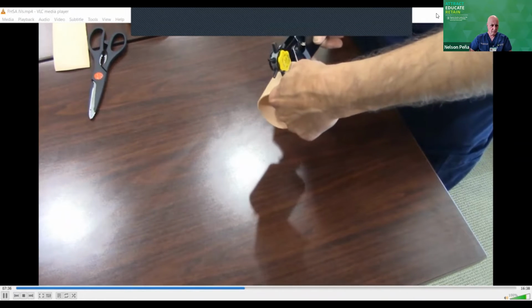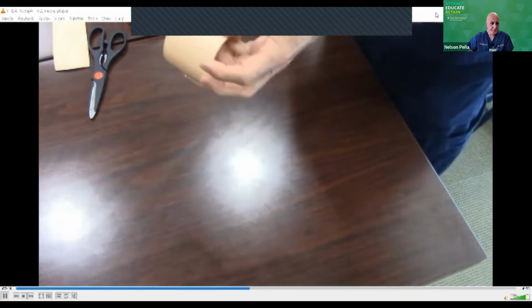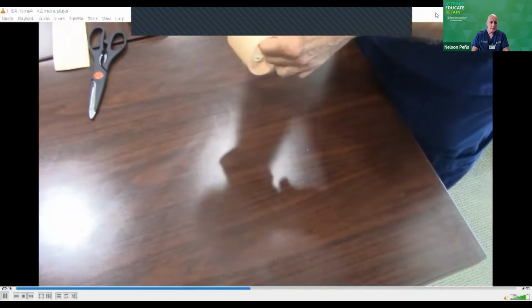So just punch a hole right in the center of it. And I may need to go to a slightly bigger size to get it in there easier. So again, just a small little hole, and you can use a punch or anything like that to get it.